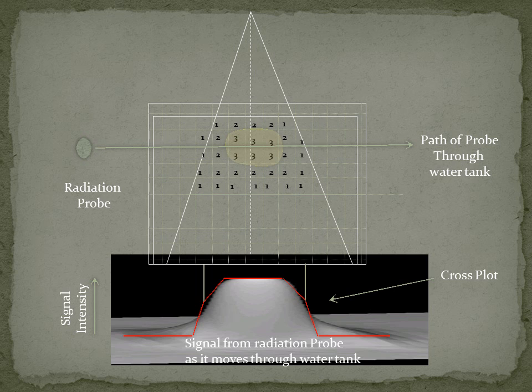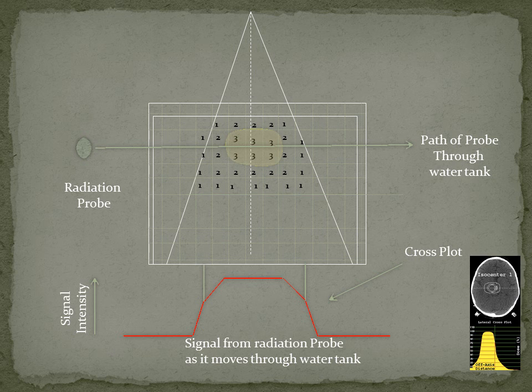And we'll see these cross plots in the lecture today. And here's one on the lower right. You see there's a radiation distribution. It's not on any particular anatomy. It's just shown there inside the patient's head. And what we have below it is a cross plot showing the intensity of this radiation beam as we traverse and we look at the doses through the patient from left to right, right to left. Okay? Again, the cross plot, the distribution, all showing us the same thing.